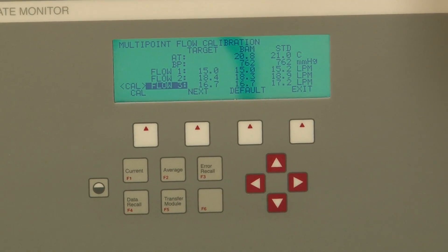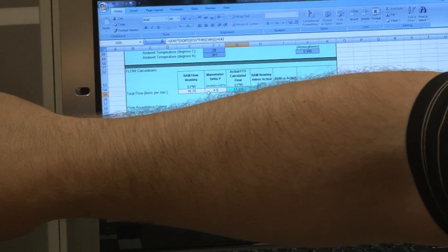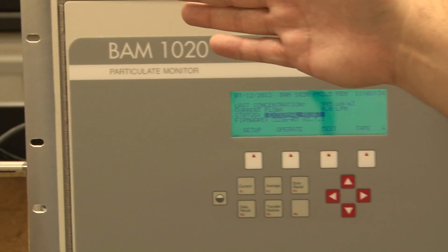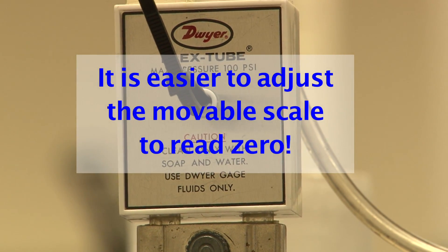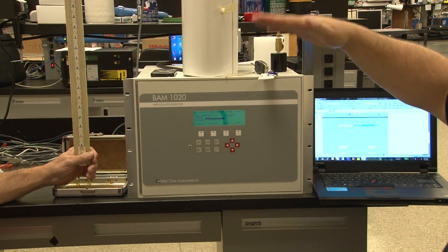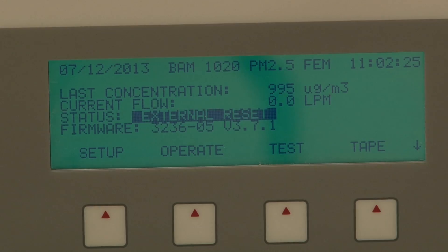Now we've recorded our corrected flows and we hit Exit. You see the water manometer gets back to its equilibrium at 0.1. Wherever you use the water manometer, whatever the base number is, it's easier to start it off at zero, though it can be difficult to get exactly to zero. As long as you get a good number to start with, you can calculate from there.